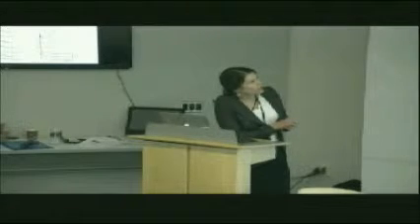Now, a separate study looked at a child who has transverse myelitis and followed the recovery. The child came in, can't walk, has serious sensory loss as well. And they did TMS and looked at 5 different muscles. And I apologize, they're cut off. I didn't realize that until I put it up just now. So 5 different leg muscles. And what we're showing here is the left and right side MEP, the motor evoked potential for these different muscles. This is at baseline, this is at week 6, and this is at week 12.